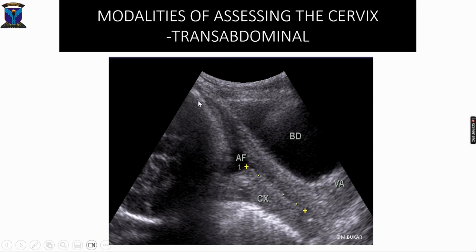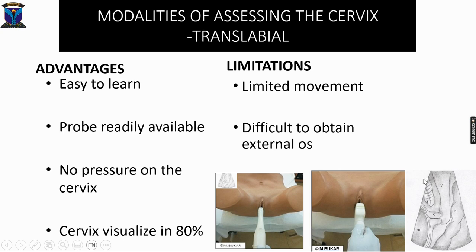This transabdominal image shows the bladder and vagina. You can define the cervix and identify the internal and external os, but it is difficult to define the cervical mucosa — all you can see is the stroma. Image quality is poor, and there is shadowing from the fetal head. If the fetal head is down, it could obscure assessment of the internal cervical os.